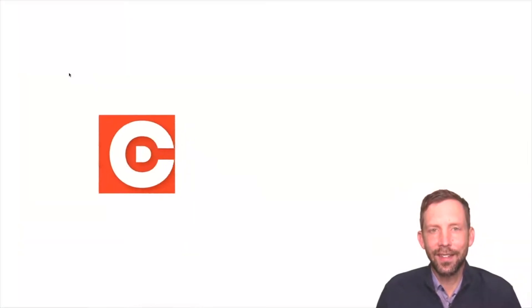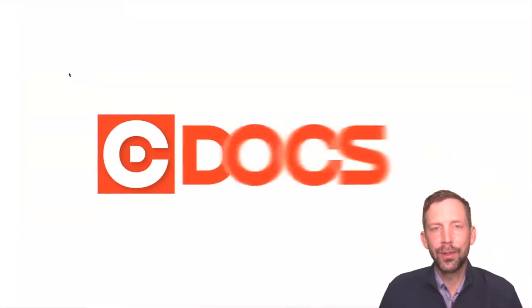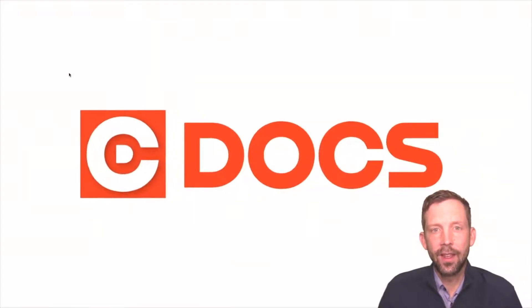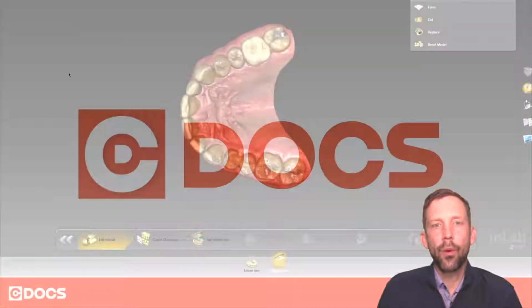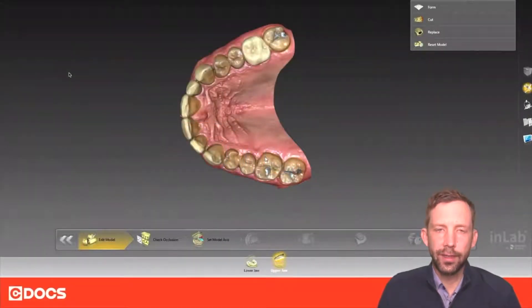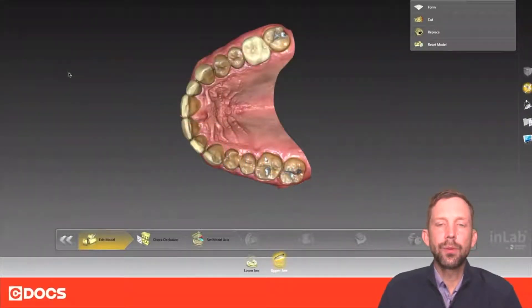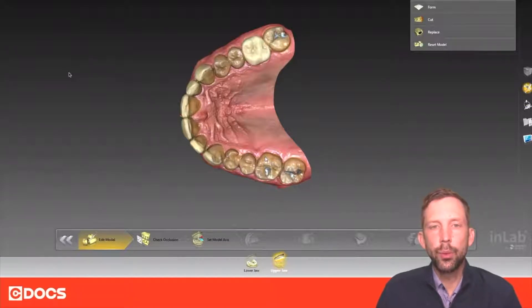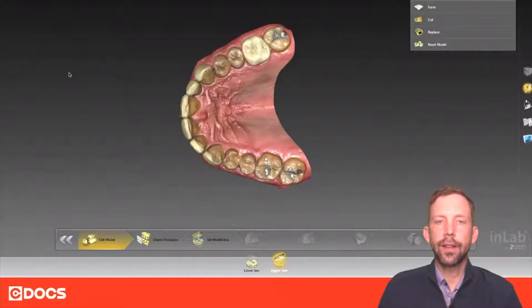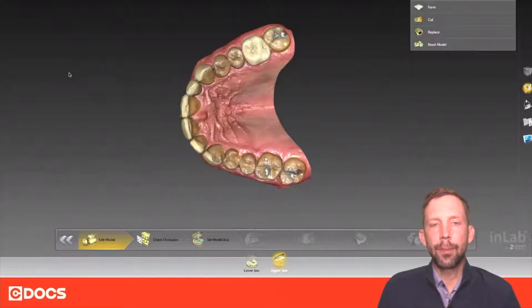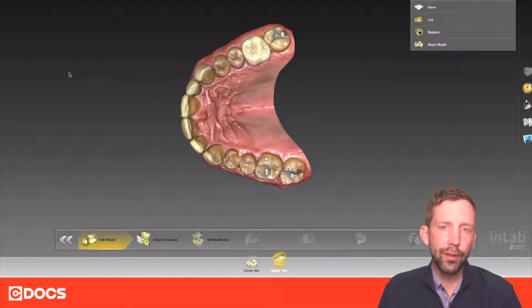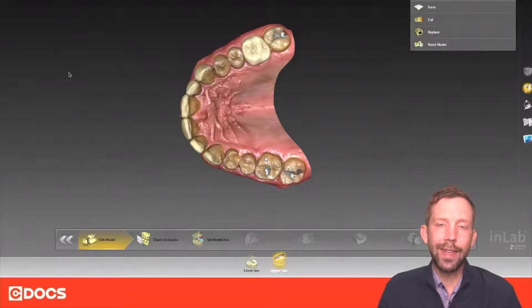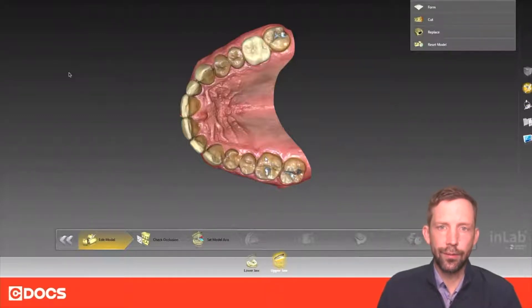Hi, I'm Mike Scramstad of C-Docs and welcome to the tip of the day. In this tip we're going to talk a little bit about 3D printing. As 3D printing becomes more popular and more and more dentists are doing this, we need to start looking at the different applications, different types of models you can make, and also the ease of use of doing this.